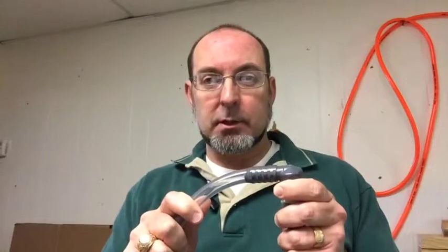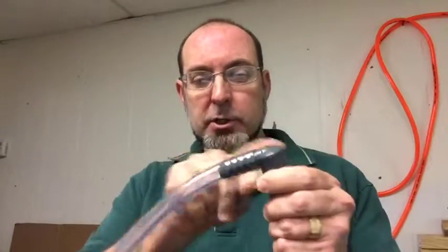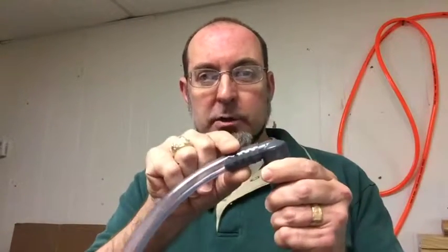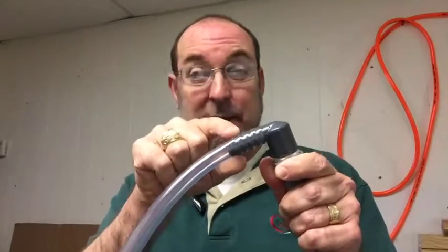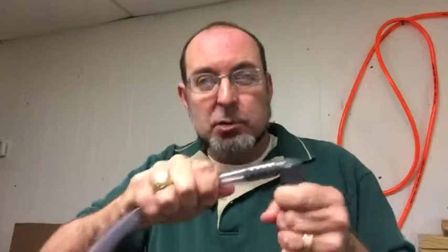People have been asking me how to change the hoses on their cooler heater. Our hoses use this kind of larger than normal 90-degree elbow. This is not the same connector we have in our hose, it's a smaller version. But this is the connector, this 90-degree elbow, and it's actually larger than a standard hose barb, so you can't just pull the hose off.